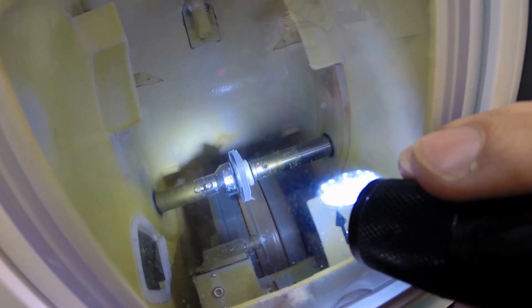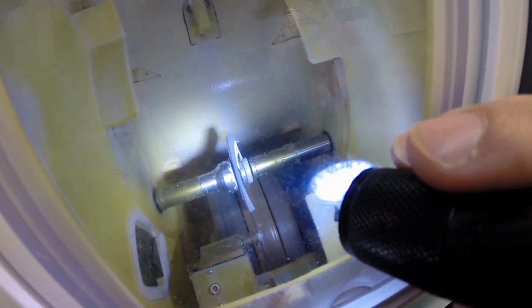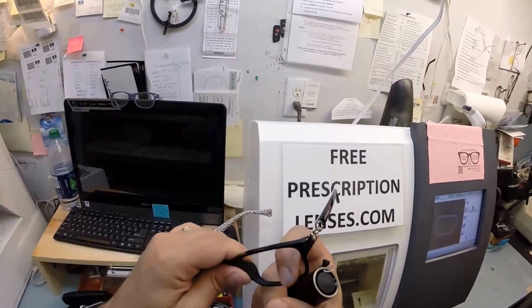So now it's coming down. Your lens is completely flat, just like a nickel. If I were to take it out now, it would stand up on its own. But now it's getting the V-shaped bevel applied to the edge of the lens so it stays inside the bevel of the frame.